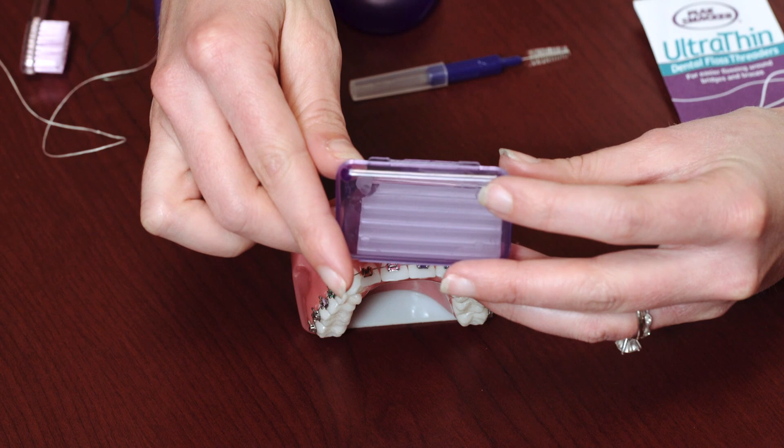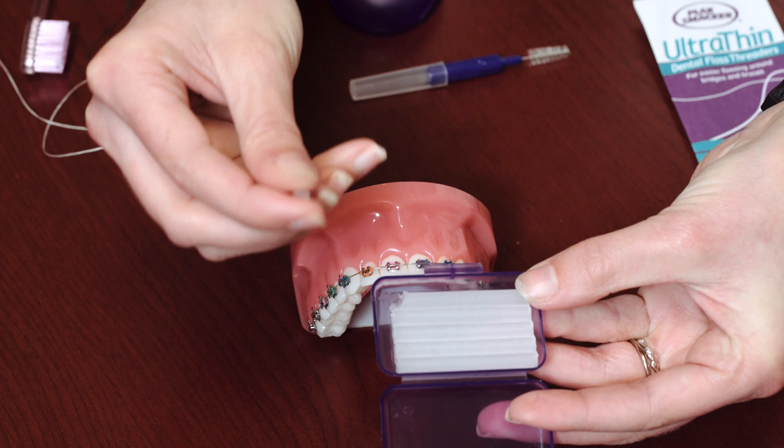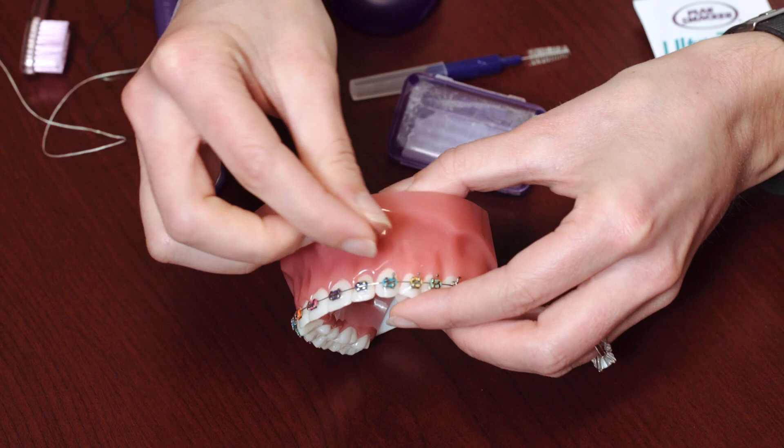If you have an area that's poking you, you can use the orthodontic wax. Take a small piece of wax, pinch it off, and roll it around in your fingers to form a small ball. Then press it on top of the area that's causing any soreness or discomfort.